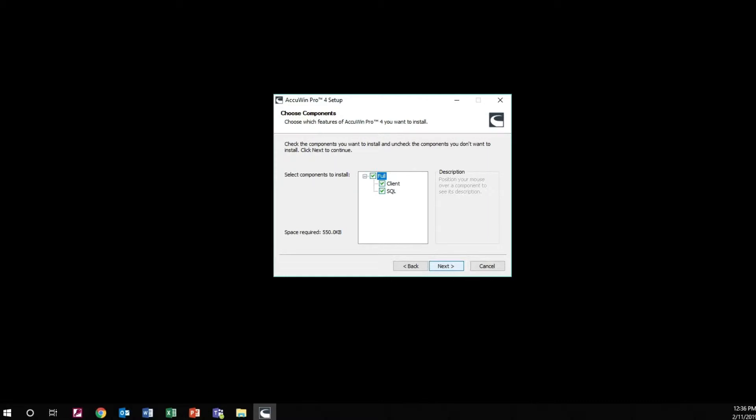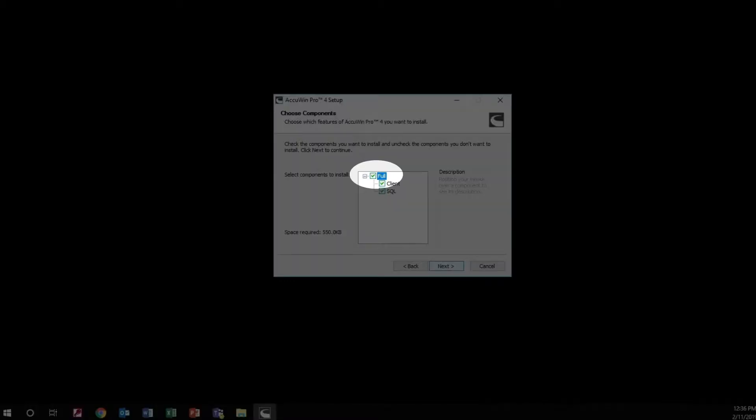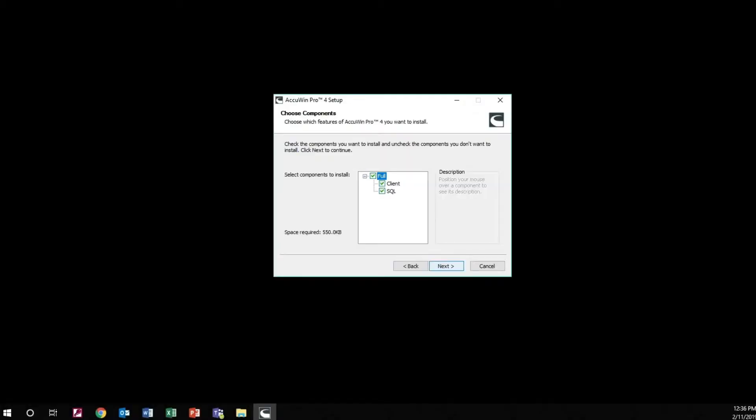Now you can choose which components you want to install. For access to AccuWin Pro from a single workstation, we recommend you run the full installation on that PC workstation. Select Next.